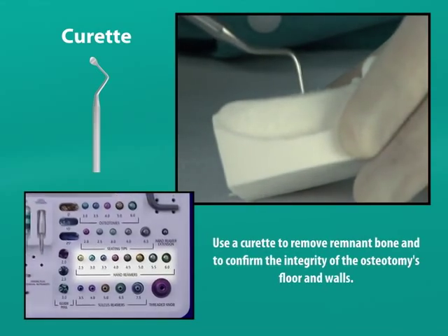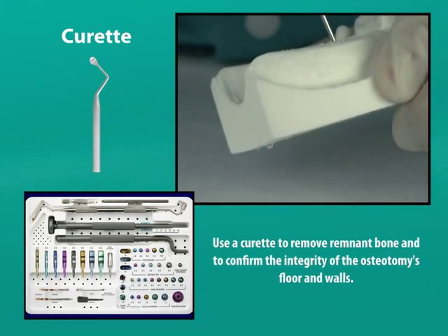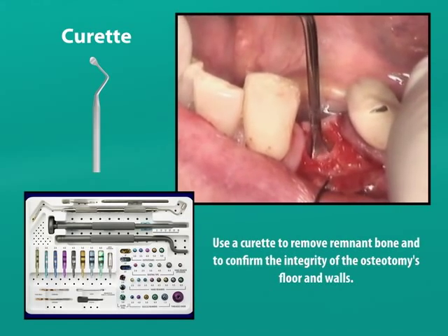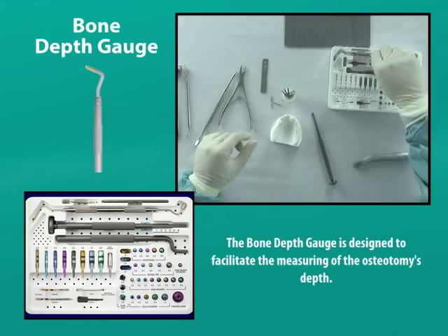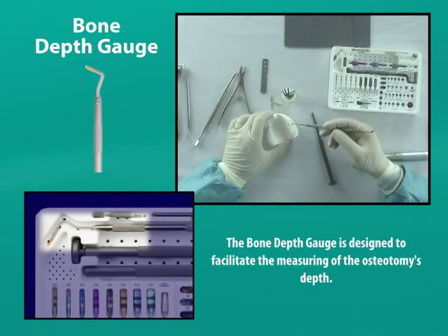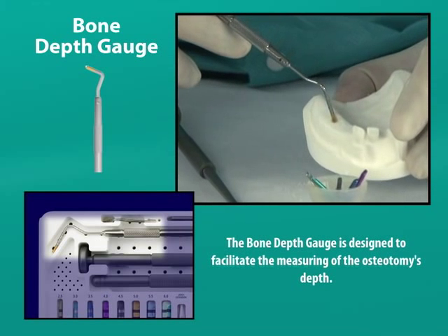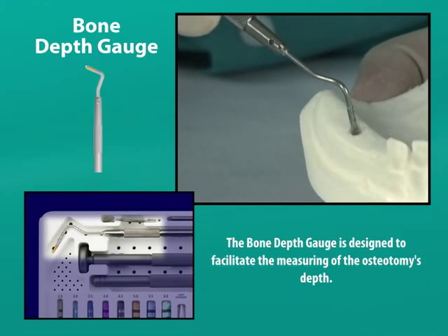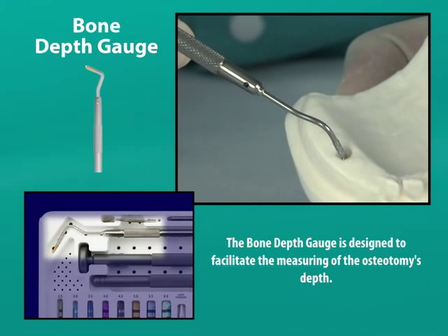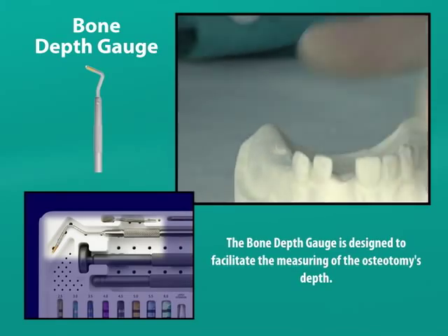After using the final reamer and prior to the insertion of the implant, a curette is used to remove any bone chips that could inhibit the seating of the implant and to evaluate the integrity of the osteotomy's floor and walls. A depth gauge flared at the end with a flat bottom can be used to determine that the proper depth for the intended implant has been achieved. The center of the osteotomy can be slightly deeper than the intended depth, so we will slide the depth gauge along the wall of the osteotomy in order to feel the tapered portion as the gauge stops at the apical diameter, revealing the true depth of the osteotomy.